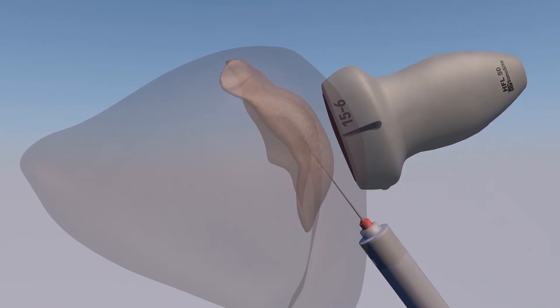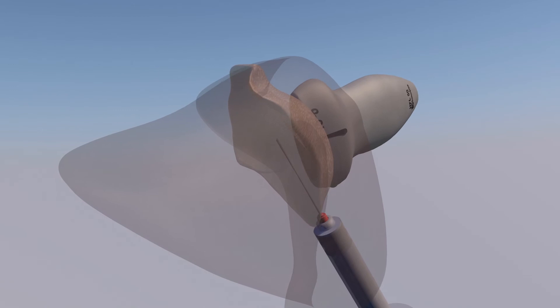And now we're just looking at the subdeltoid bursa in relation to the deltoid muscle, which is translucent here.